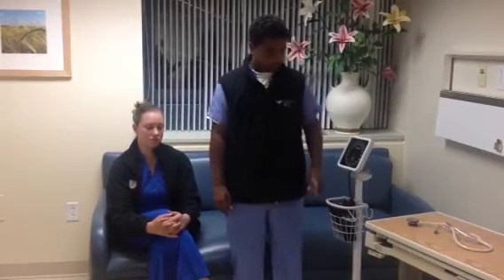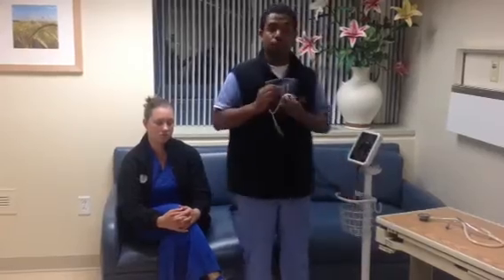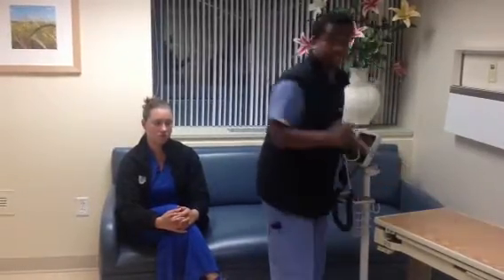Today I'm going to be presenting the proper way of using a blood pressure machine and doing a manual blood pressure via a patient. The first three things that you're going to need for equipment is a sphygmomanometer, a blood pressure cuff, and a stethoscope.